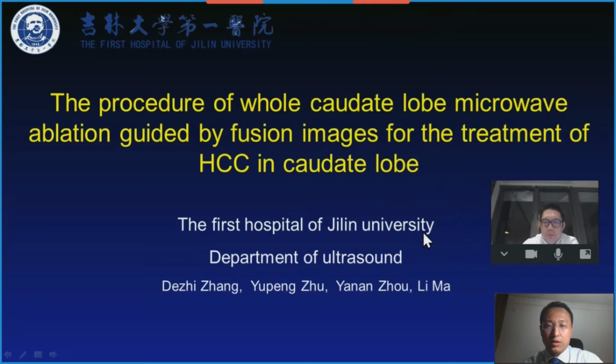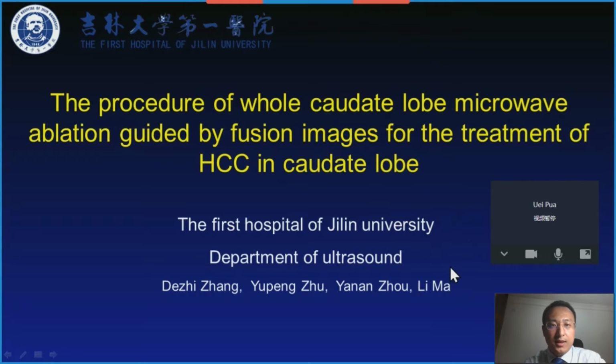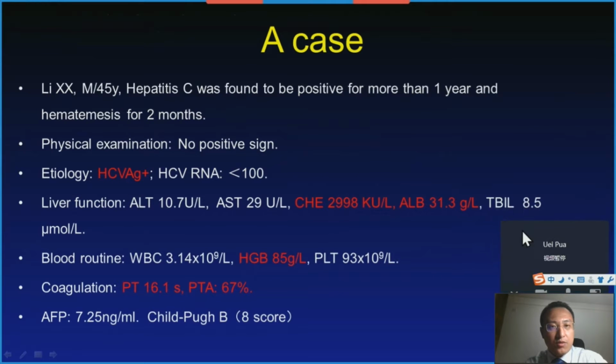I come from the First Hospital of Jilin University, and my topic is the procedure of whole caudate lobe microwave ablation guided by fusion images for the treatment of HCC in caudate lobe. Let's start from a case.